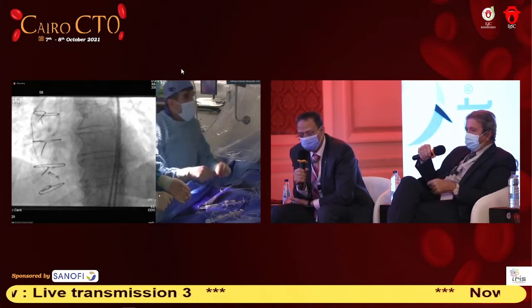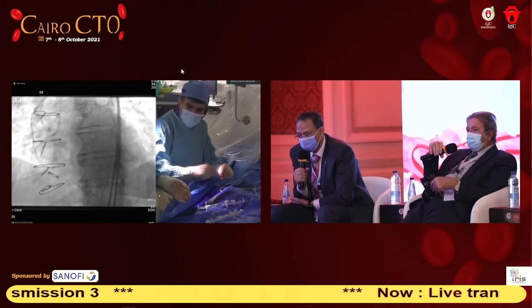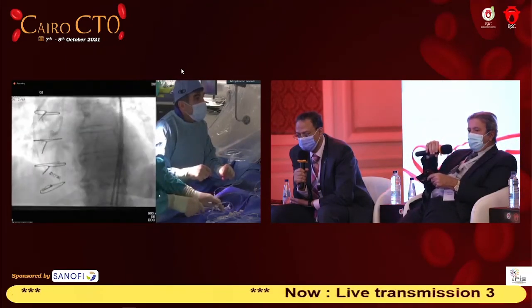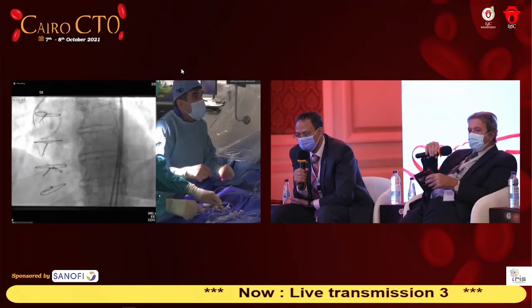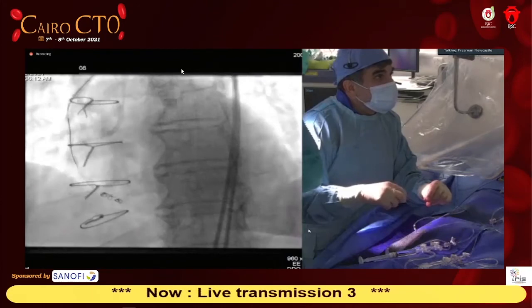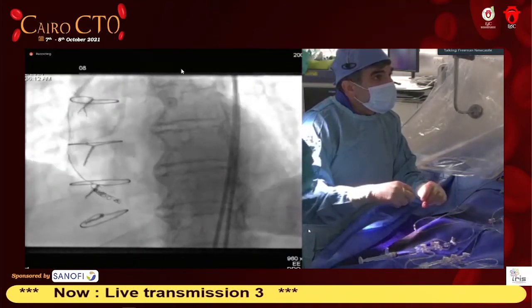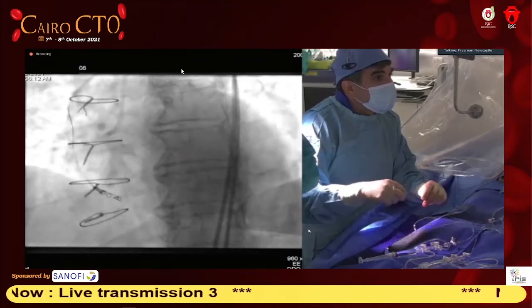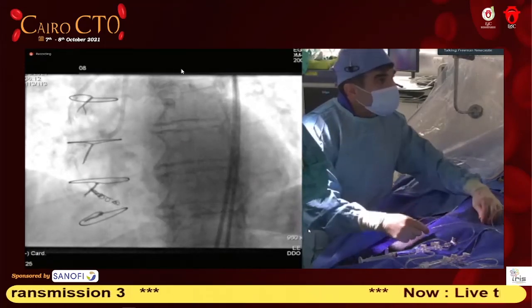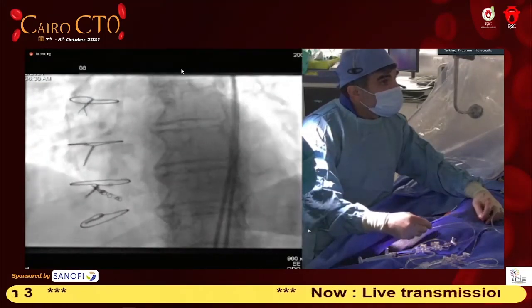Absolutely. If there is any message I want to get across, it is this: you could do a vein graft angioplasty, and some of them will survive, but we know up to 20% will have an event sooner or later, and the vein graft will deteriorate. So my approach is, the minute I know that the vein graft is starting to deteriorate, if you can get your native artery, do the native rather than the graft. And to be honest, even if you send it to somebody who could do it, if you don't want to do it.